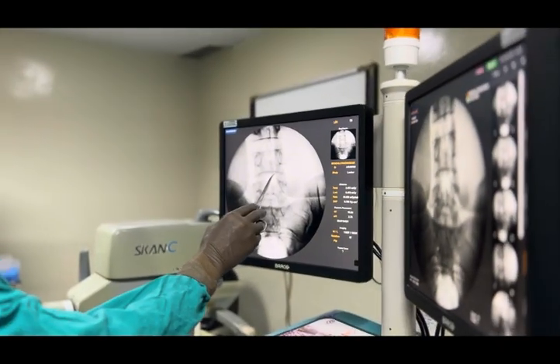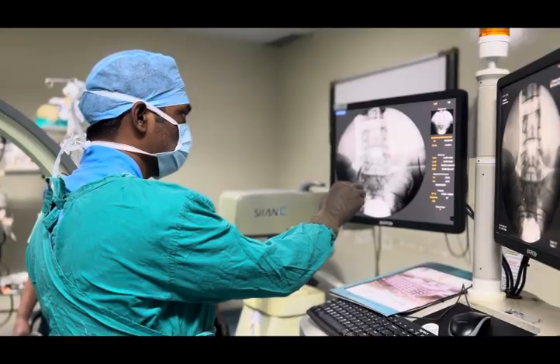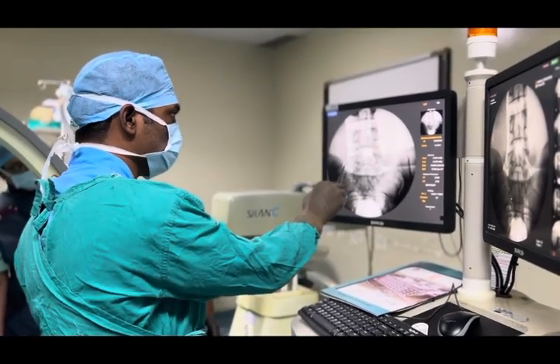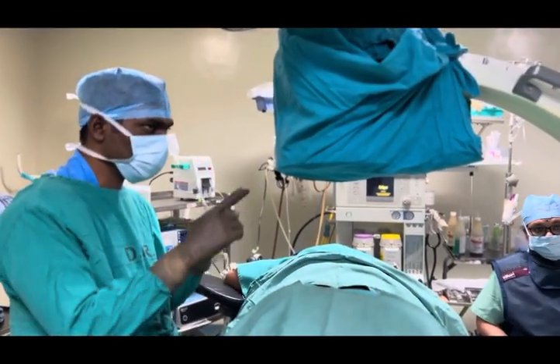She is having pathology at the 4-5 level. We are going to target the L5 root here. So we are going to put the needle here. In this particular C-arm, this side is left and this side is the right side. Now we have tilted the C-arm to do the squaring of the vertebrae.